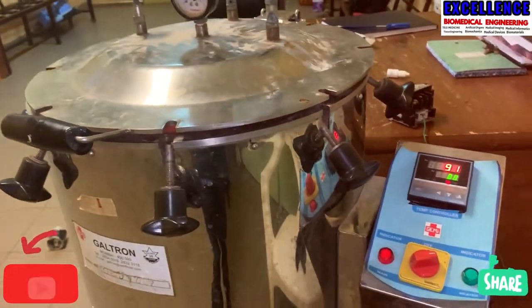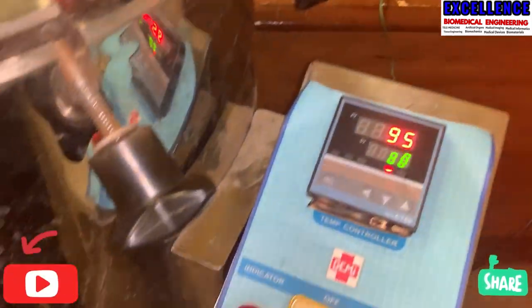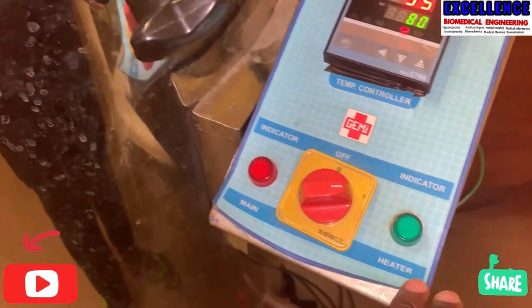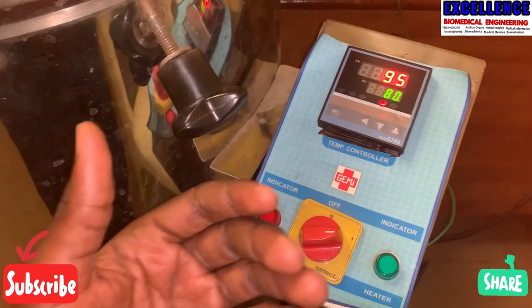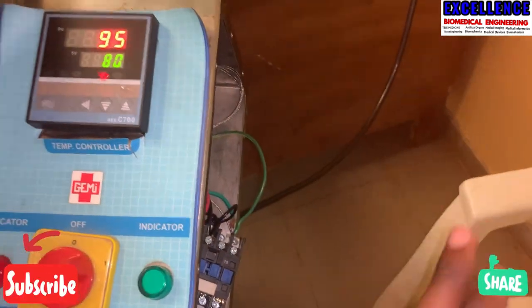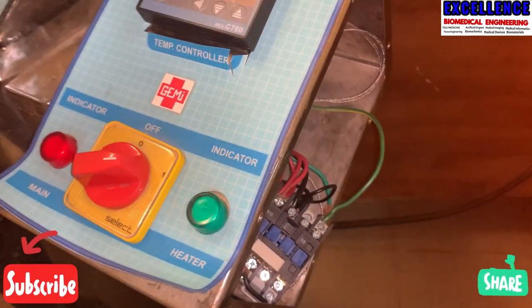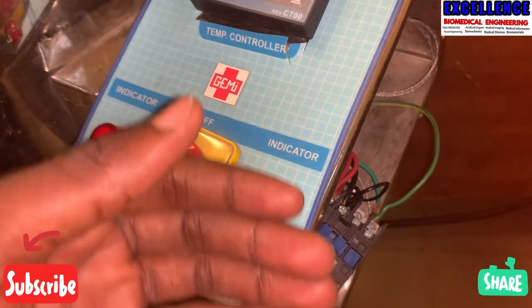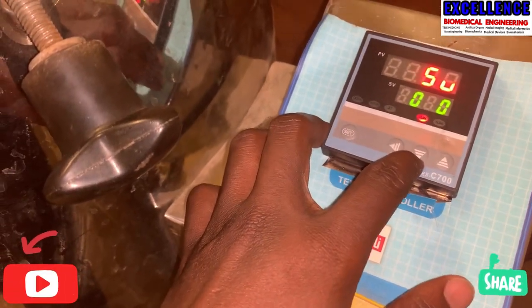There are some common problems with this autoclave. Most often, problems come from it not heating — if the controller is coming up but there's no heat, it must be the element. If the controller is not coming on, check for a loose connection or a faulty controller.